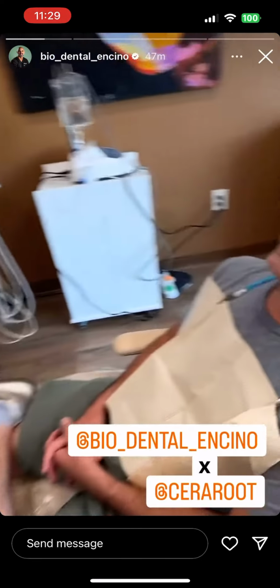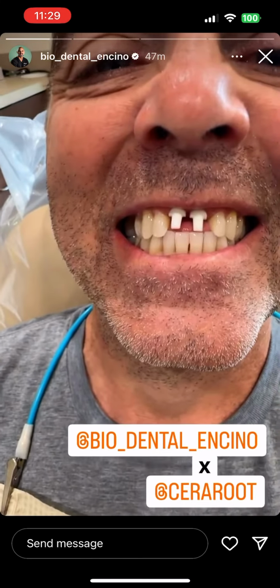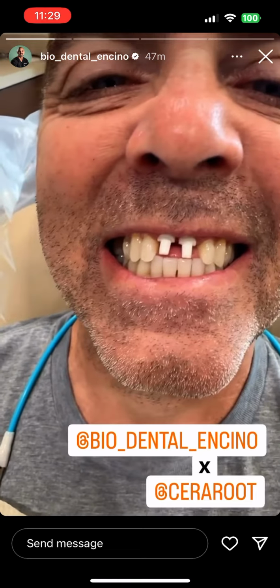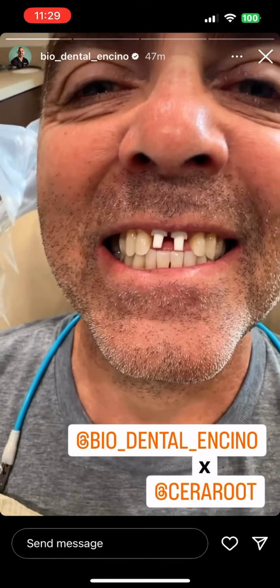Eric, let's take a look. Everything's healed up nicely. The implants have taken beautifully. Now today we're going to prep the abutments right to the gum line and get an impression. And in about 2 weeks, we will finally finish this case. I think it went well. Eric, you happy? Yes, I am.